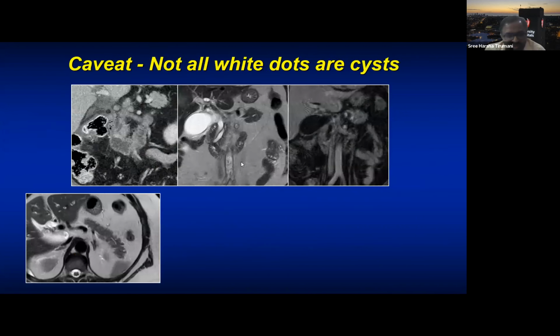There's one patient I recently saw, and I was really humbled by how cysts can create confusion in the management. In the end, this didn't turn out to be a bad thing for the patient, but this is a patient who had a double duct sign with a mass at the ampulla. You can see that even on the MR, which is very artifact-ridden, but there is some enhancement in the ampulla. So this was the initial MR, and then the patient underwent Whipple for that.